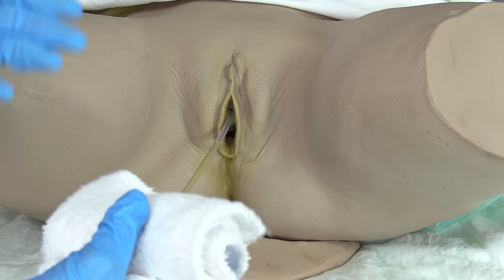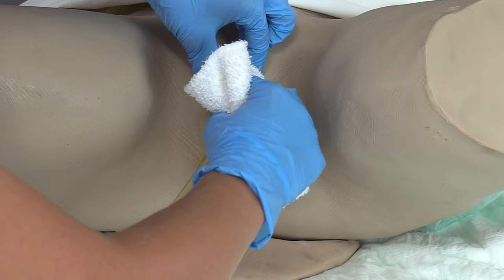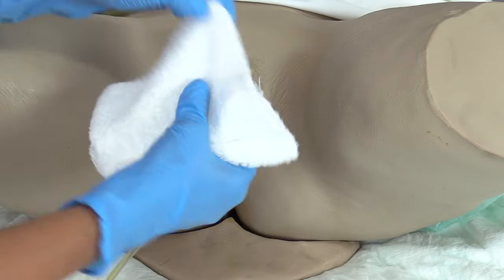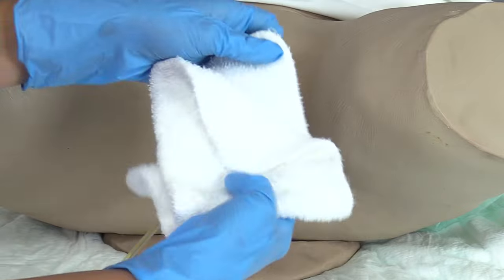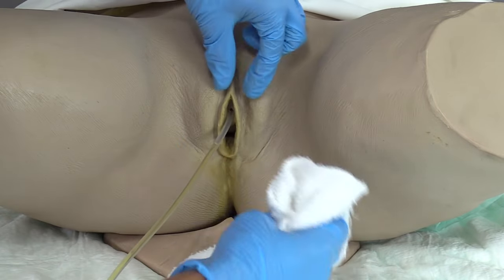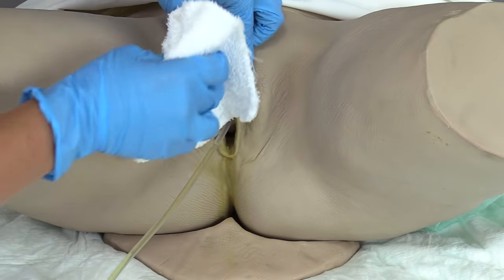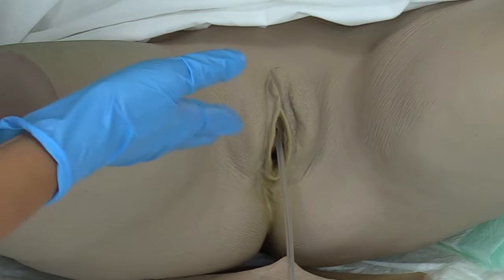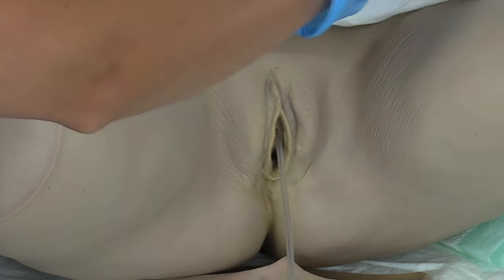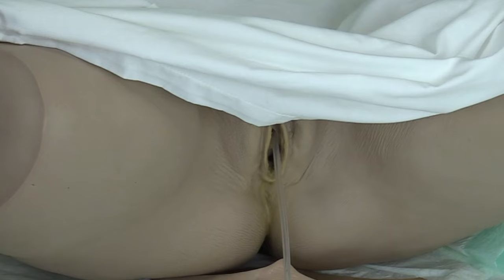It's dry, and we're going to blot those areas dry in that same exact sequence. So top to bottom, pull back, top to bottom, pull back. You really want to make sure you get the areas dry because germs love to grow in wet places. So we don't want any water left behind. Then top to bottom, discard. Then gently turn the patient onto their side to provide care to their backside, making sure that you put no tension on that catheter.